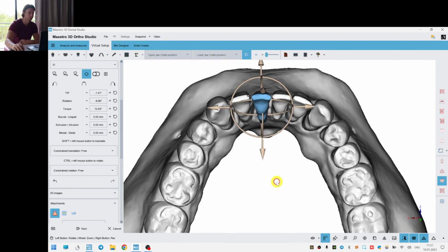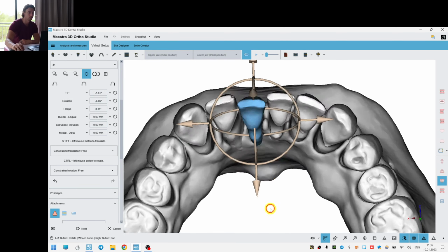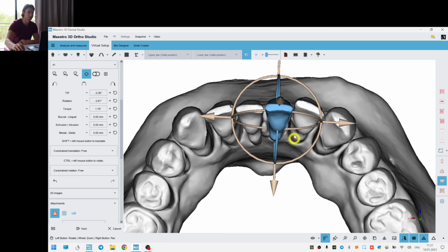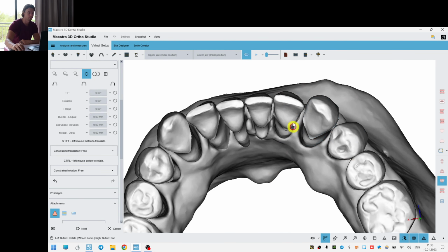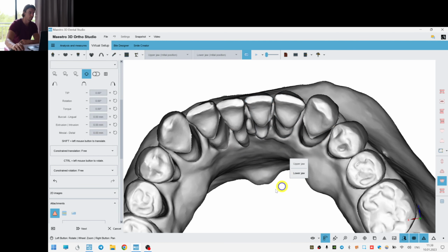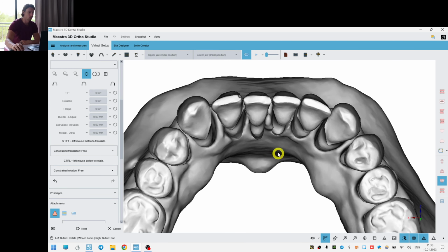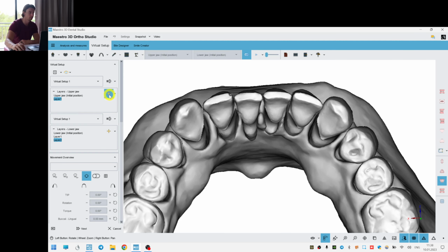Well, can we reduce this tipping? I think yes, we can. Let's reduce it a bit. We still have some gaps, which is good for us. Well, let's create the layer 2 for both arches.